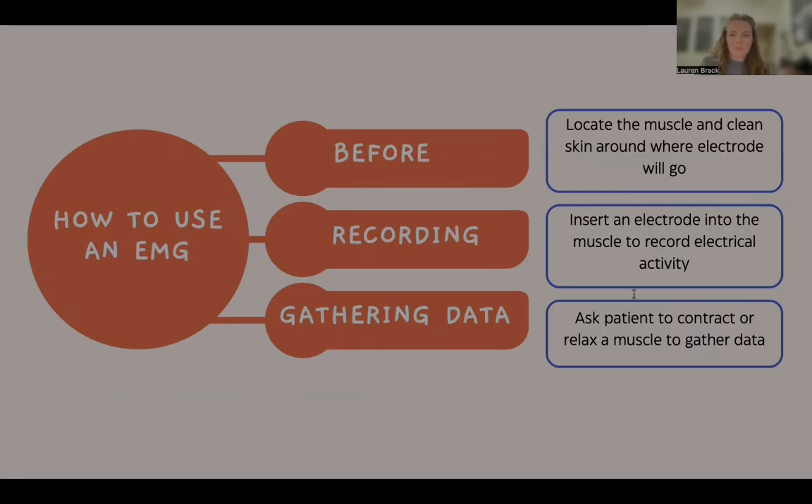The first step in performing an EMG is to identify the specific muscle or group of muscles to be assessed. This is typically done by examining the muscle and selecting the area most relevant for the patient's symptoms or condition. Once the muscle is located, the skin around the electrode placement area is thoroughly cleaned. This step is critical, as it ensures better contact between the skin and electrode, which is necessary for recording accurate electrical signals.